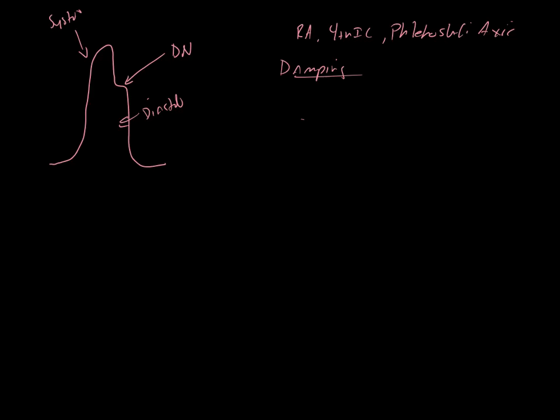So where does a balloon pump work? Yeah, so we know it's placed in the aorta, right, above what? Above the renal mesenteric arteries and below the subclavian that comes off of the aortic arch. Okay, good. You've got radio-opaque markers on the balloon pump, so you got to get a chest film, right?